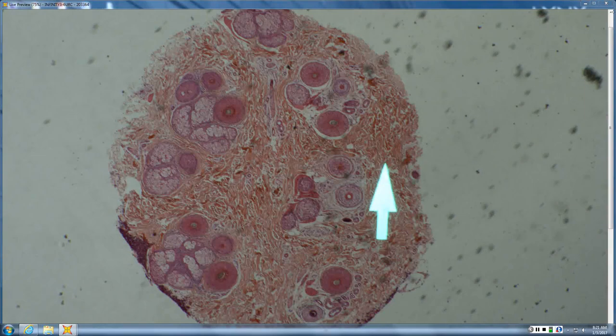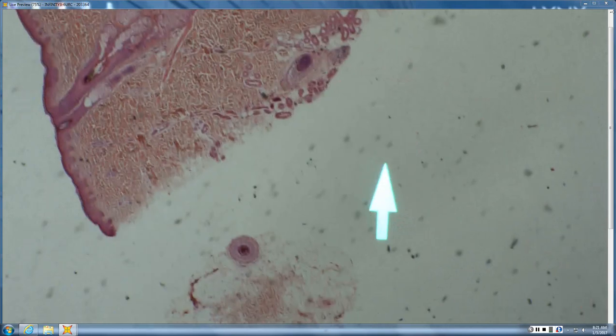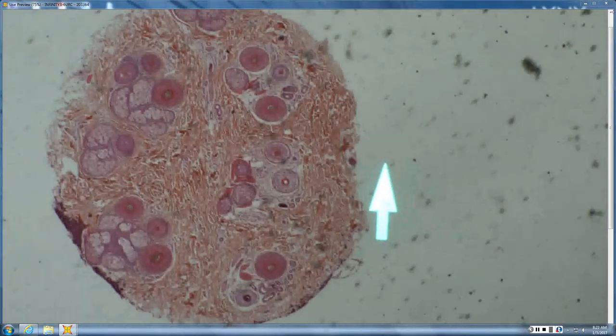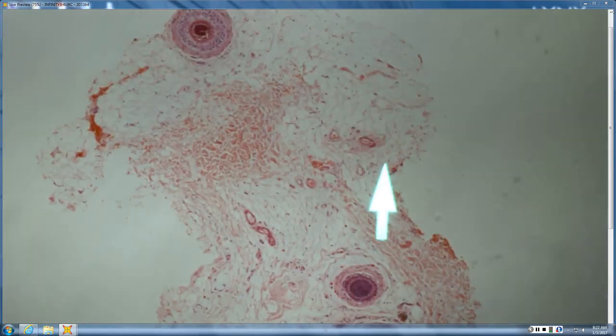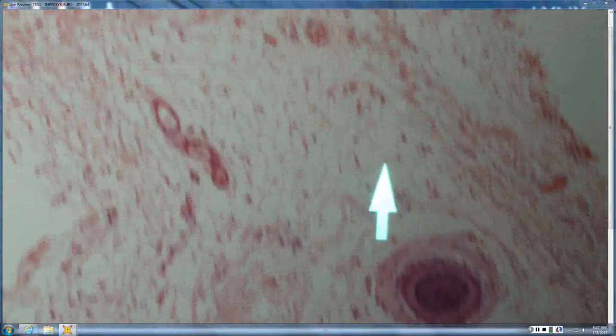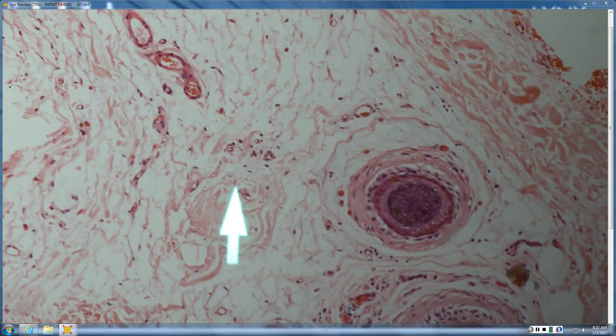Miniaturization, not a lot of inflammation. Sebaceous glands intact, so what's your differential? Non-scarring alopecia with miniaturization: pattern, AA, syphilis. It's important to keep all of those in mind. And in this one, I don't see anything more diagnostic. I don't see EOs. I don't see anything diagnostic for alopecia areata, but by history, that's what this was, AA.